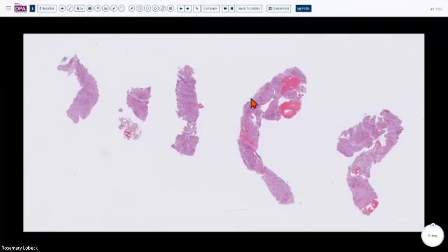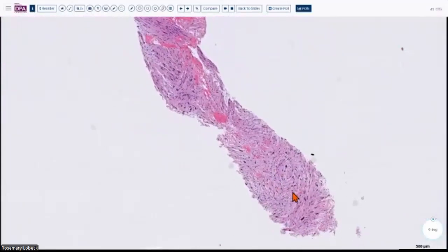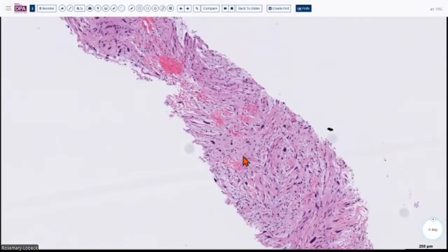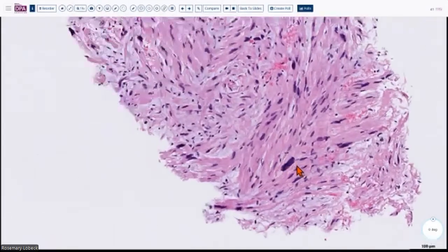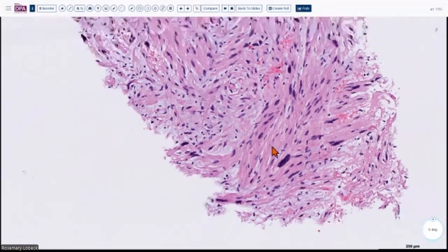So I want to show you a few more examples of benign lesions that can do this. These are some of the lesions that most of you might encounter in routine practice. So here's a needle biopsy from a deeply located soft tissue lesion that was indeterminate by radiological examination. If we zoom in, we will see it's basically a spindle cell lesion with some myxoid areas and also some pink areas. But what meets the eye over here is the fact that you have all these really large nuclei, right? Large nuclei that have irregular nuclear borders, and also very hyperchromatic.